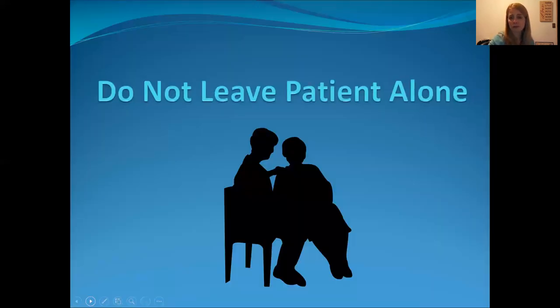Don't leave the patient alone. You've got to monitor them. You don't want them to slip into stage 2, which is delirium. You want to keep them in stage 1. If you see that they're getting a little bit more sleepy, and you'll be able to tell, and when we get into clinic you'll see what I mean, you can turn it down. You're using that volume, and you're changing the liters of nitrous to oxygen based on your patient, based on them feeling enough of an altered state of consciousness to take that anxiety, take that edge off.